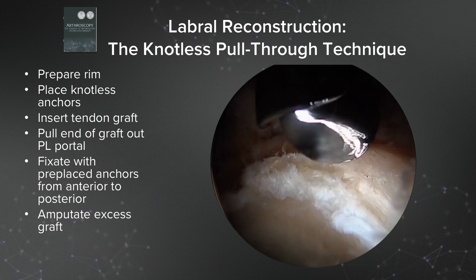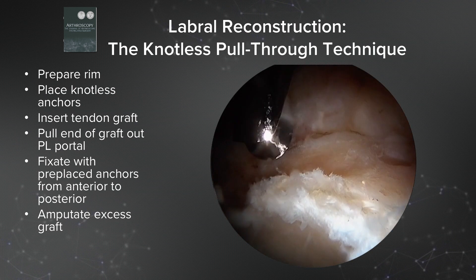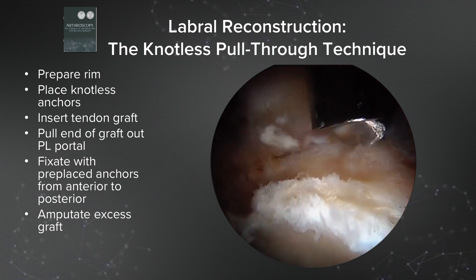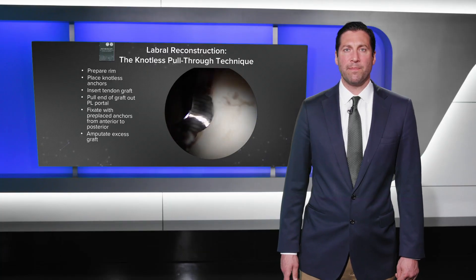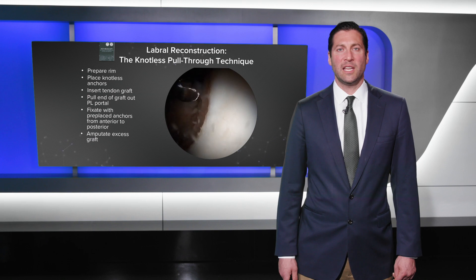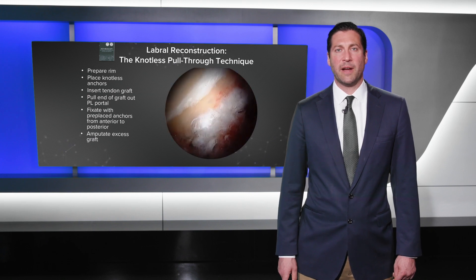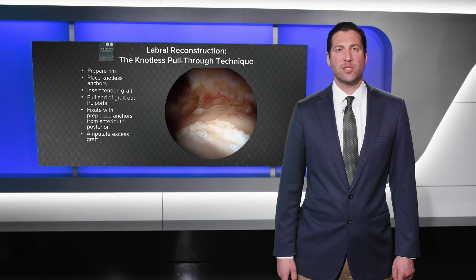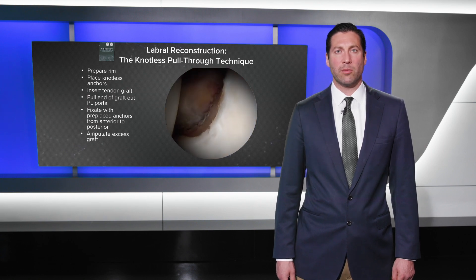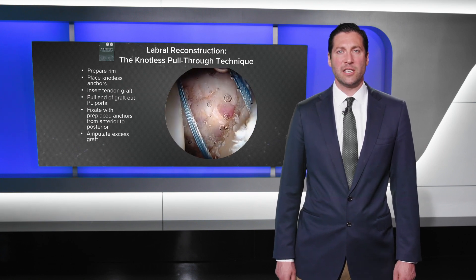We approached this problem with a labral reconstruction using the knotless pull-through technique. First, we prepare the rim — we've removed the degenerative previously repaired labrum and prepared the entirety of the rim. This will be a circumferential labral reconstruction using the knotless pull-through technique.